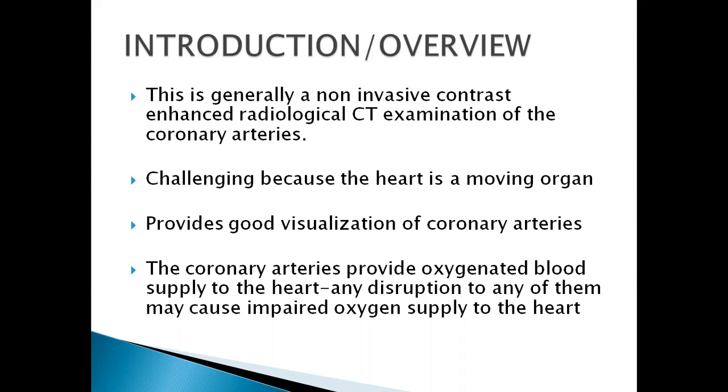But this examination is very challenging. Why? It's challenging because the heart is a moving organ. And as we know in radiography, motion is one of the major causes of artifacts. So this becomes a challenge that you have to overcome when doing this examination.